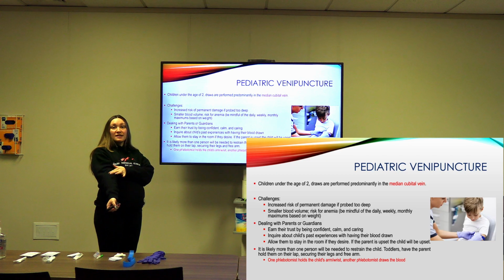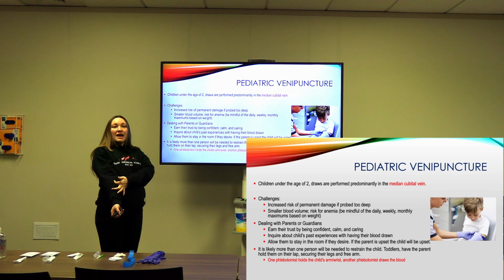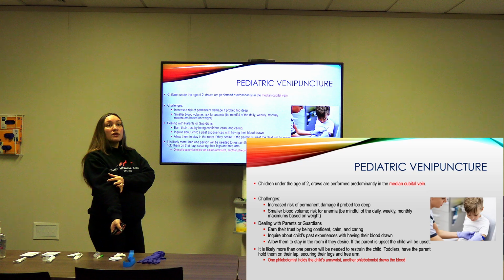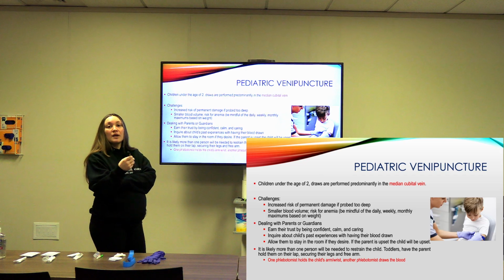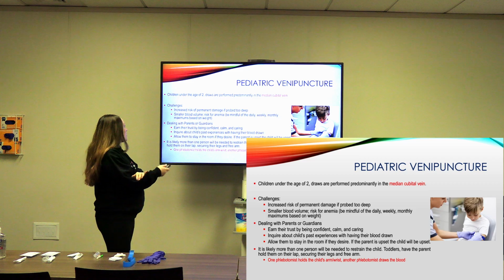You can generally see it right in the center, but you're not going to poke right in the center. You're going to move down because we have less length up top. So you're going to poke it low and envision ending the needle tip in the center of where you can see it, okay? So the general rule of thumb for the littler humans is to poke a little bit lower than you would expect or than you would want to at first.